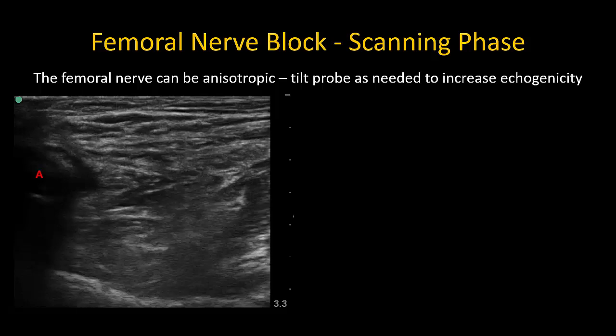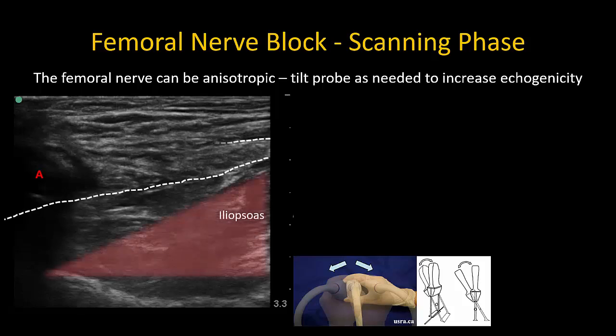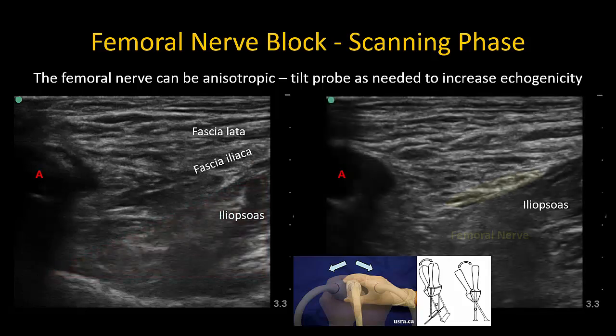The nerve often exhibits a degree of anisotropy, so it may not always be immediately obvious. Tilt or rock the probe back and forth while looking at the expected location on top of iliopsoas and under fascia iliaca, and the nerve should light up. Identify the borders of the femoral nerve, especially the lateral edge, as the objective will be to enter the fascial compartment at this location with minimal needle-to-nerve contact.